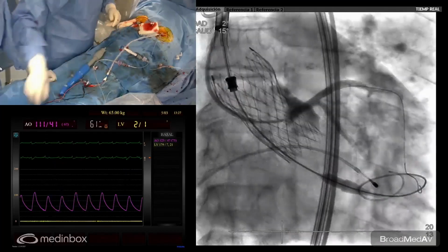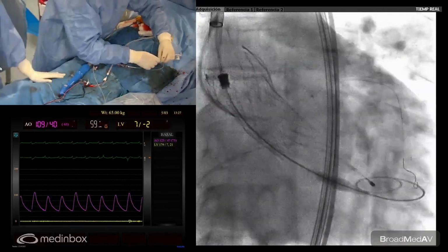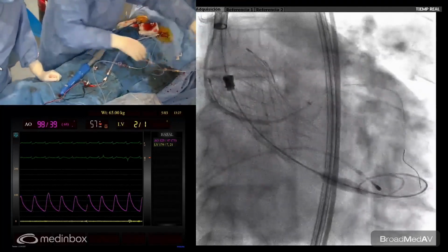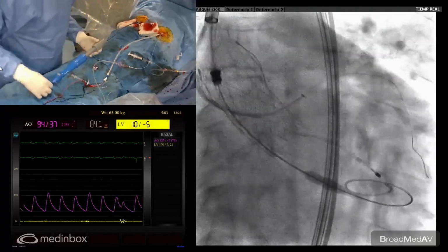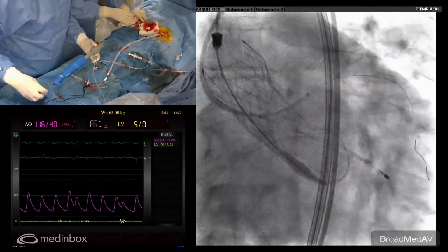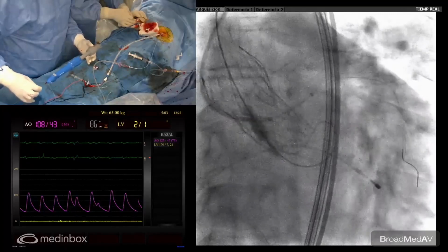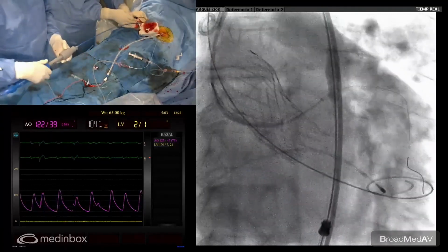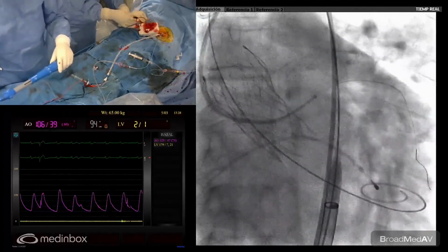I will retrieve the delivery and another tip that I use is keep it there inside the ostium just in case. I will retrieve the device and then I will check if I need post dilatation. I centralize the nose cone. This is my shaping wire doing this. I pull this, have the set prepared, and we will check it.